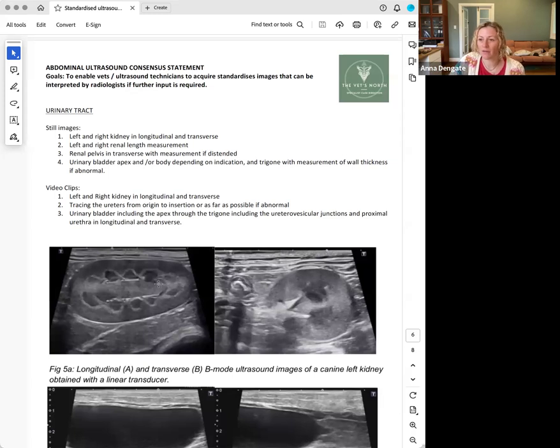One of the ways to differentiate, and we will definitely miss nephroliths, and we will definitely call nephroliths that were actually connective tissue and fat next to the calyces, is to ask: is the brightness uniform when you're fanning through the kidney? Is it surrounding every one of the calyces? And if it's not, then maybe it is more likely to be mineralization or a focal change.